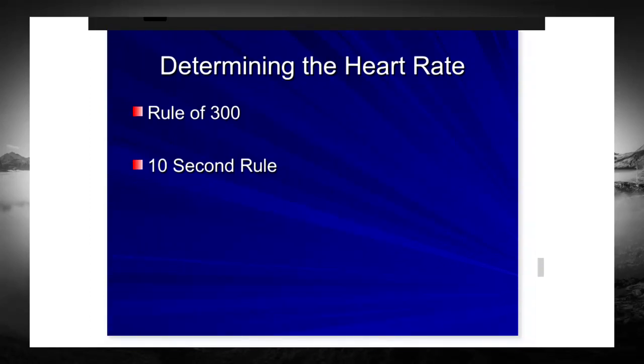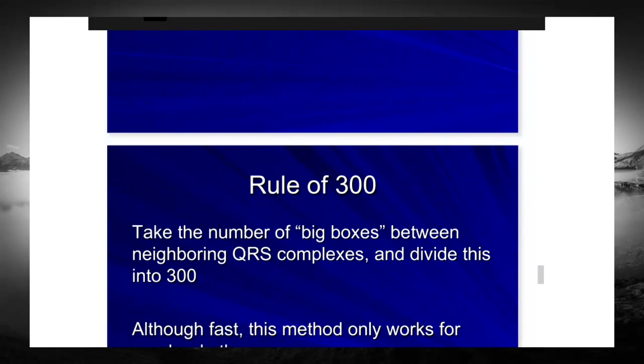So now, determining the heart rate. There's actually another rule as well, the rule of 1500, but it's the same thing as the rule of 300, just not using it the same way. So don't worry, you'll see the rule of 1500 as well. That one always seemed extremely difficult for me, and it seemed pointless to do it, so I don't like teaching it. And then the 10-second rule.